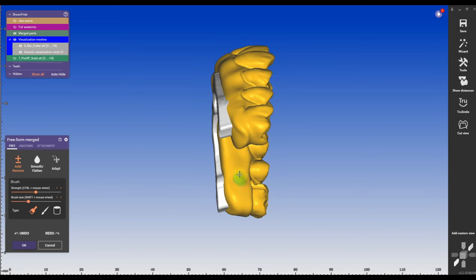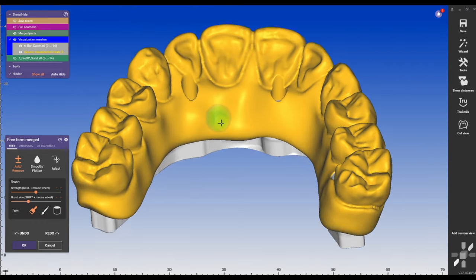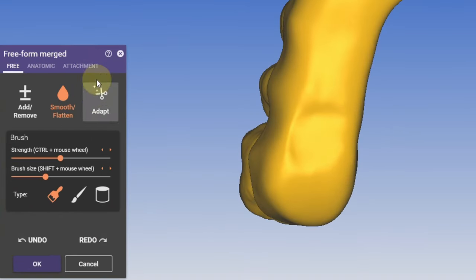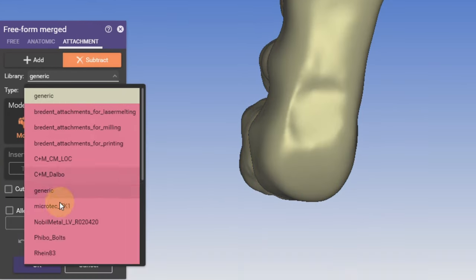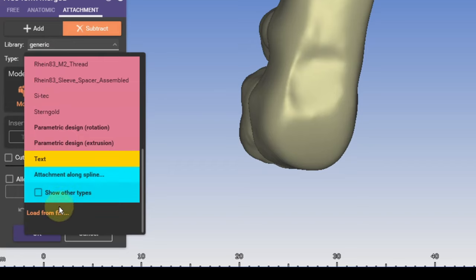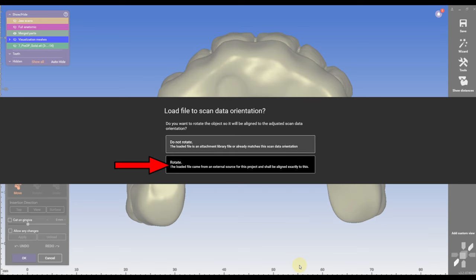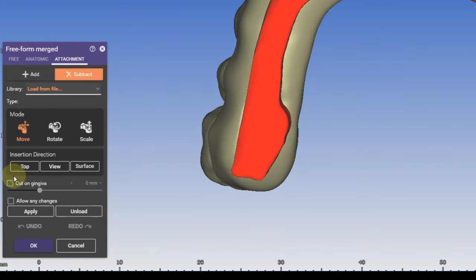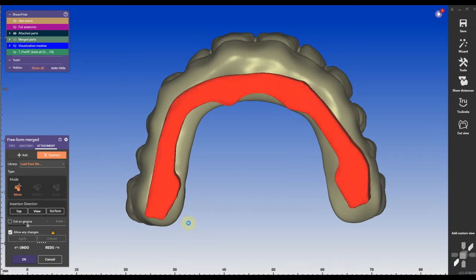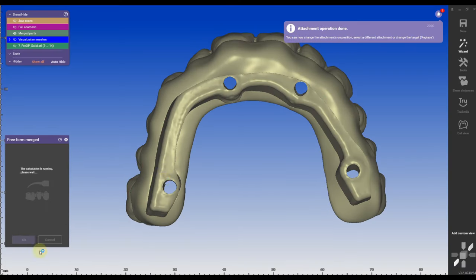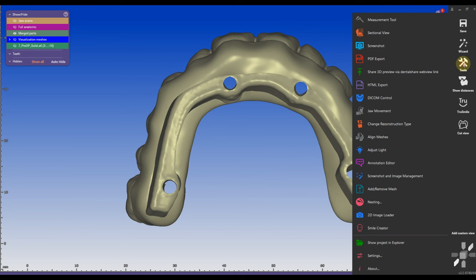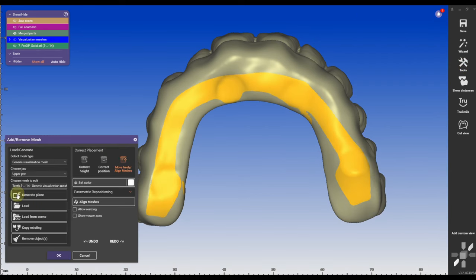Just fill up the holes so I don't create any holes. Fill it up with a plus sign, smooth it out a little bit. Then go to attachment subtract, go to loads all the way down on the bottom, load scan data and it's the bar cutter again. Press rotate, allow any changes and apply and then the bar will cut the bar out of the zirconia.